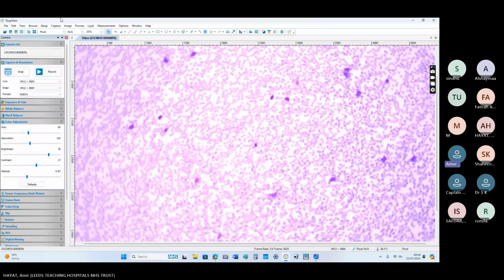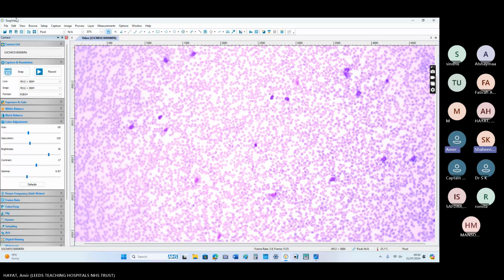She had blood tests done and the lab called you because the hemoglobin is on lower side, 105. The white cell count is 54, and the platelet count is on lower side as well, 140. The biomedical scientist is worried for the abnormal cells and high white cell count in the blood film.